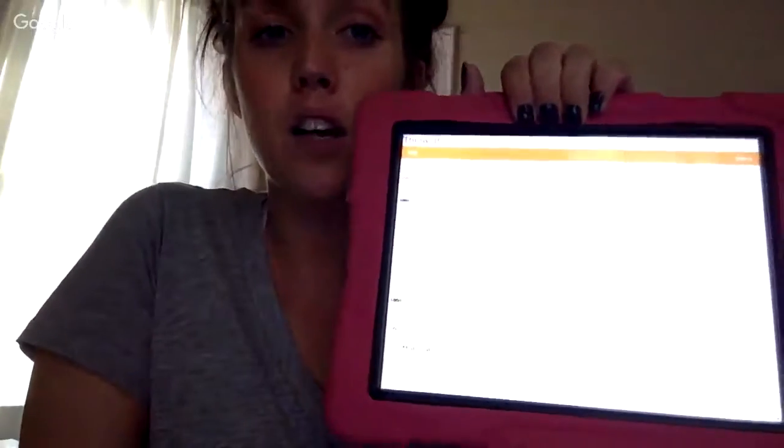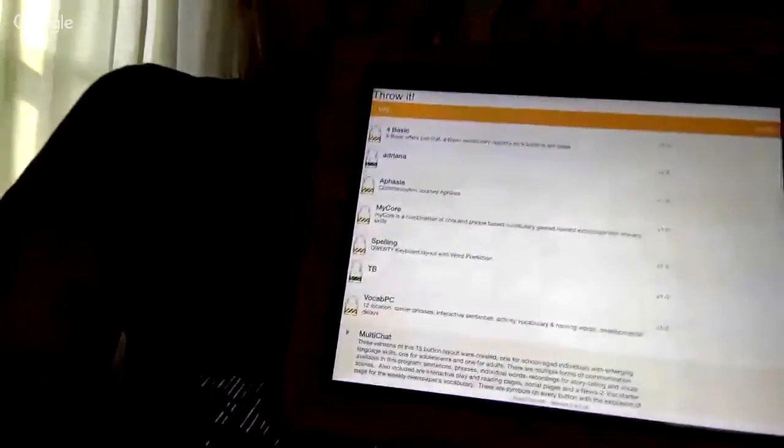Like I mentioned, even within a single application, you can create a lot of different TouchChat versions. We have multiples at our center, and lots of children interchange them, and they can be changed throughout the day and throughout the week and even further. It's really nice to create those.